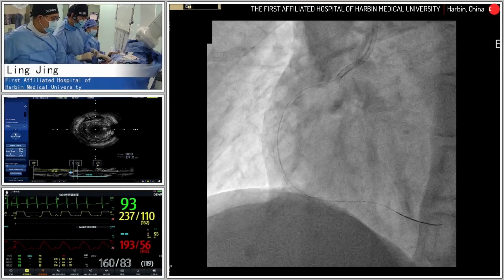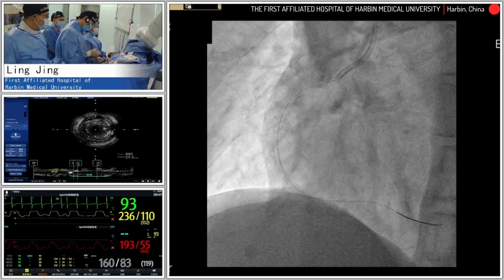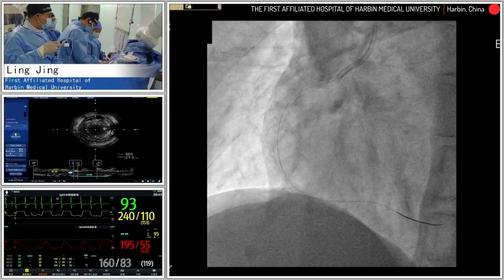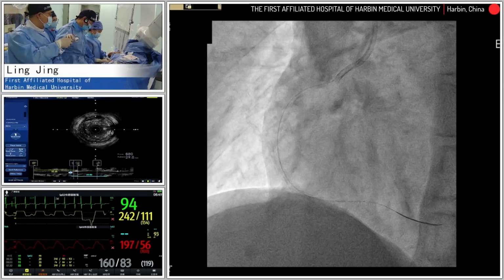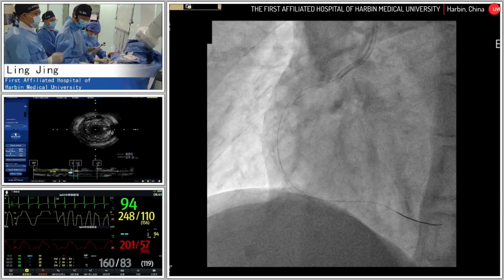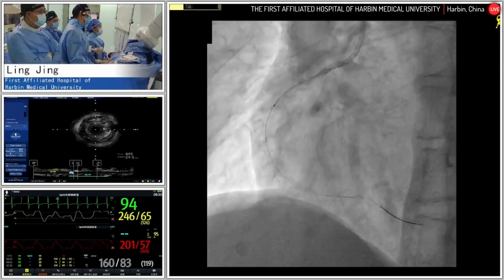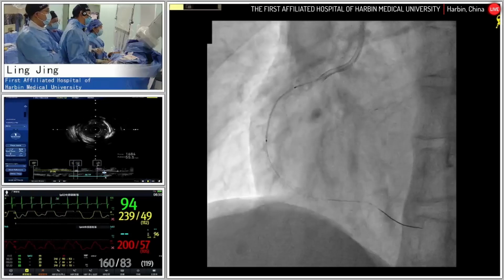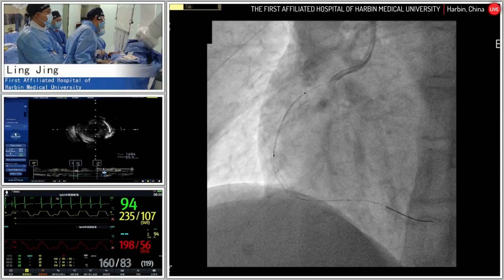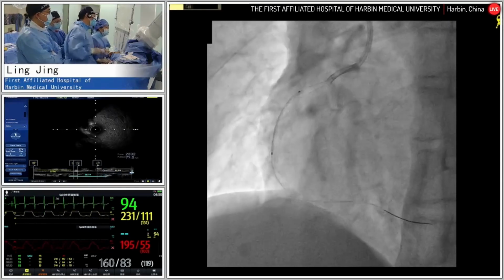And now Professor Jing is putting in the second stent of 2.75 by I think 30 or something. For this case, it's a chip patient with a high resistance in the lesion, and we are using several kinds of scoring balloons to try to modify the plaque. And also here is a special situation: after the wire crosses the CTO segment, however, the balloon or the other devices cannot pass.